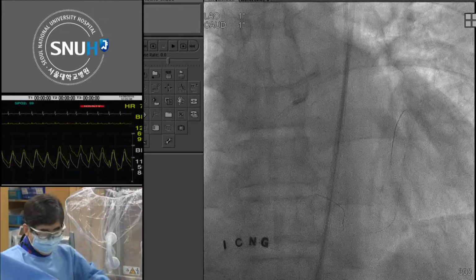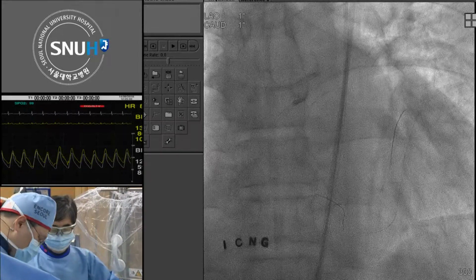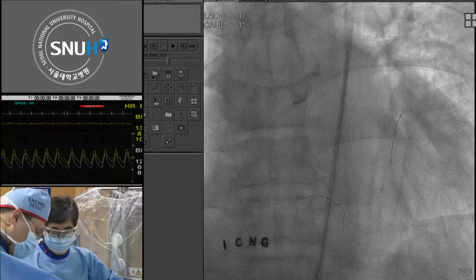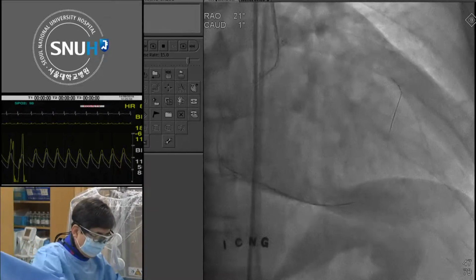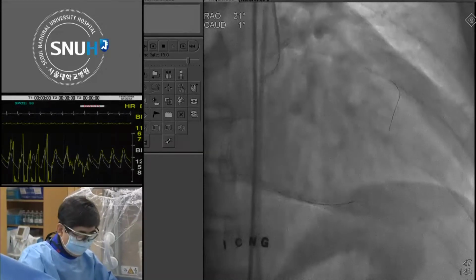I don't believe in Tornus. I have numerous bad memories with Tornus, so I strongly discourage the usage of Tornus. I'm talking about the good old Tornus, not the newer ones. Tornus definitely has a larger profile than the Caravel.